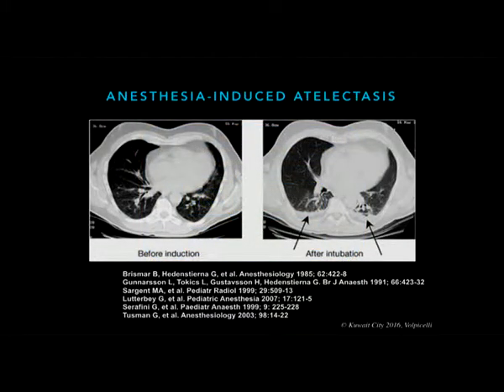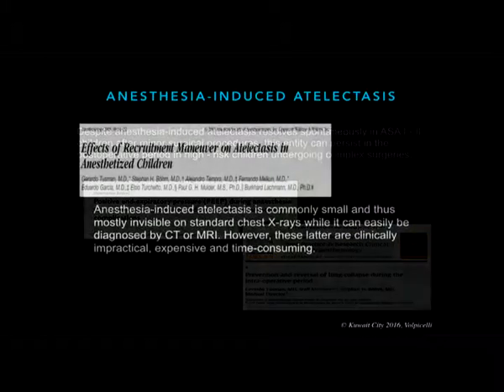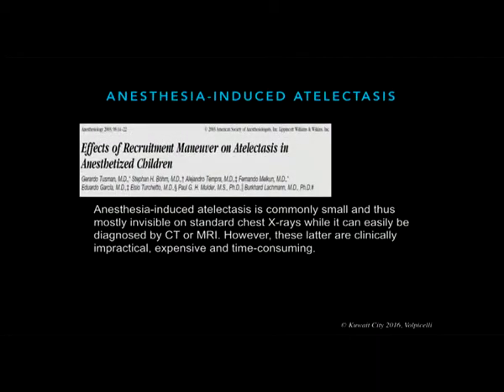And this is an example of what happens in our patients, examples of anesthesia-induced atelectasis. So what is the potential of lung ultrasound? The potential is that lung ultrasound is more sensitive than chest radiography, for example, and not so sensitive, of course, as CAT scan, but we cannot use CAT scan in our patients.